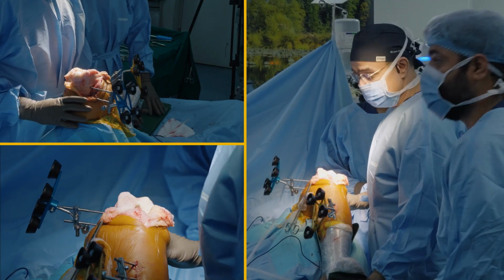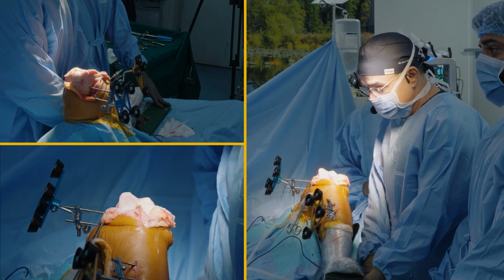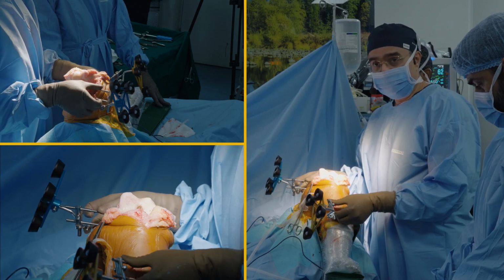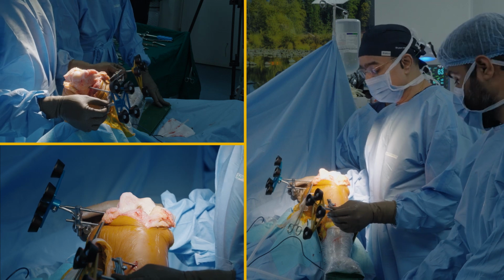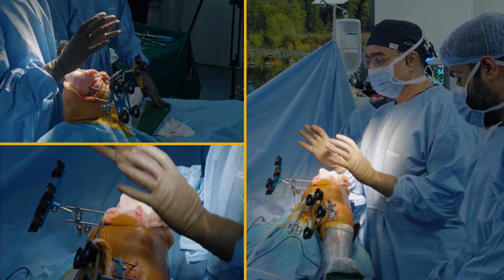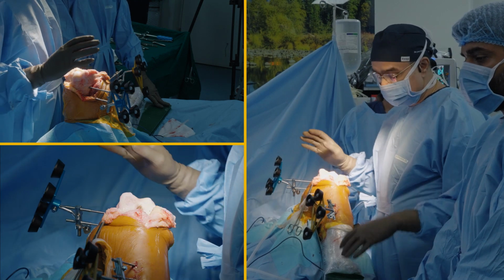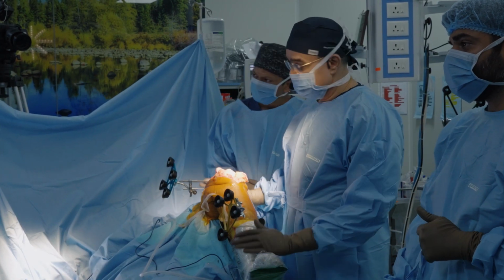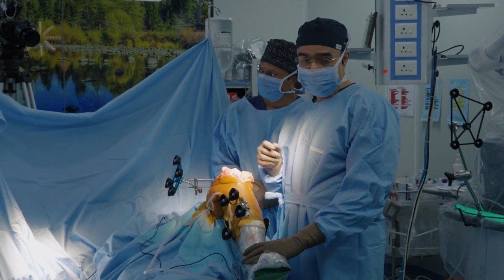So when we start, this is the tibial array, this is the femur array. Before you start, you make sure that all these arrays are secured properly and there is no movement. Everything should be snugly fitting there. There should not be any movement at all, because if it changes, the complete 3D image that we are going to generate in the robot will change. So now it is good. This array position looks good and we are good to go. We start with the femur mapping now.